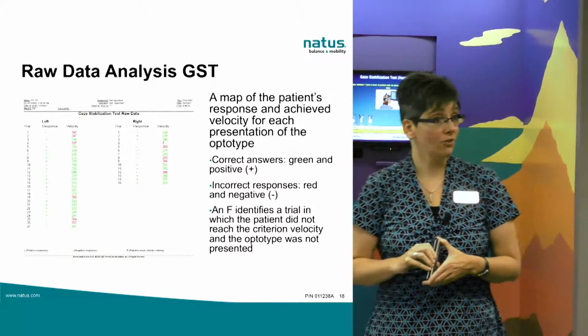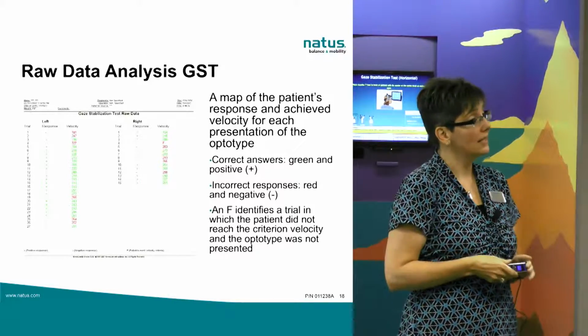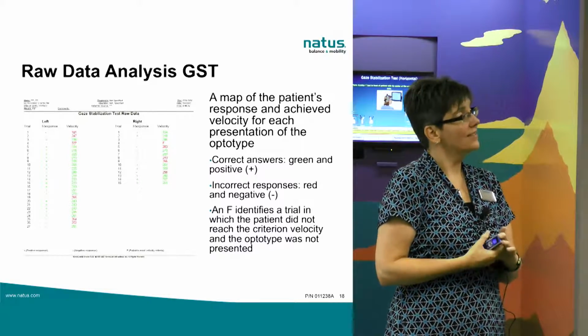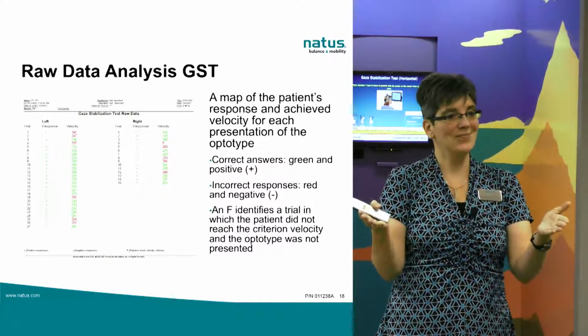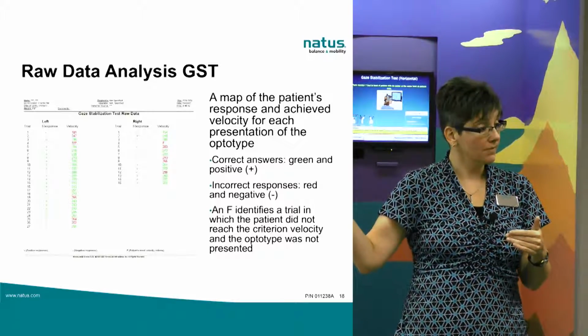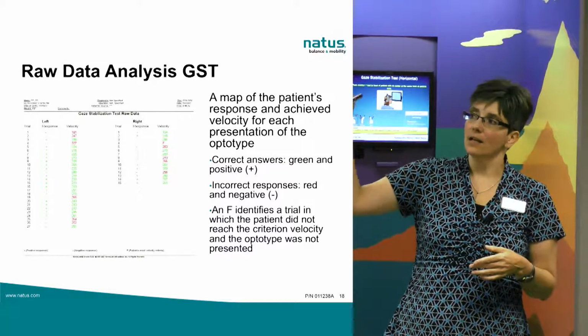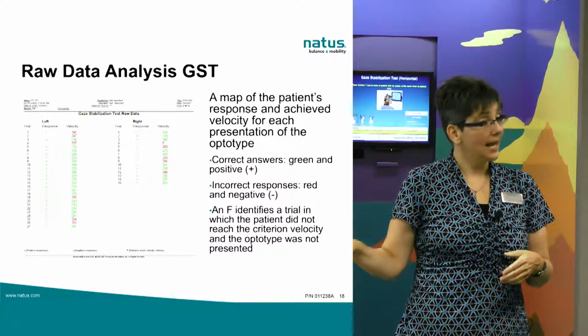Failed to reach the threshold velocity. So you'll see that there's no plus or minus there because the optotype wasn't even presented. So this data allows you to compare left side to right side, and it also allows you to see how the patient performed, if this data is collected throughout the test.